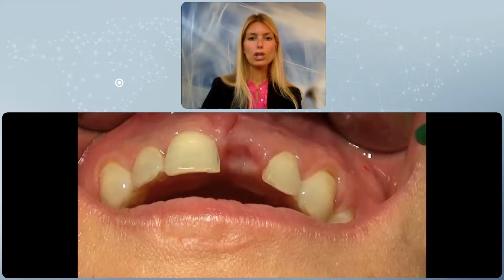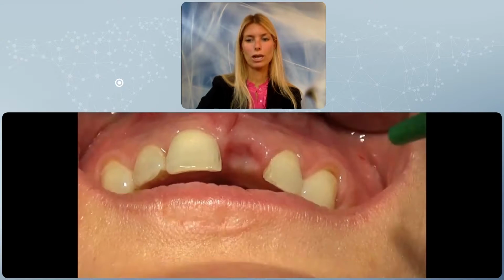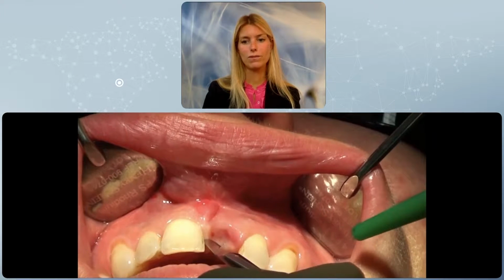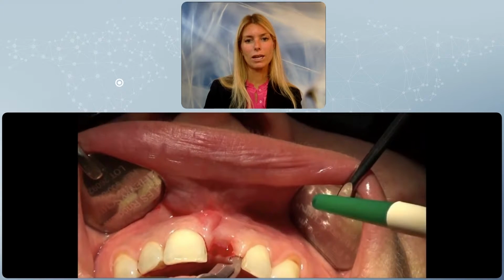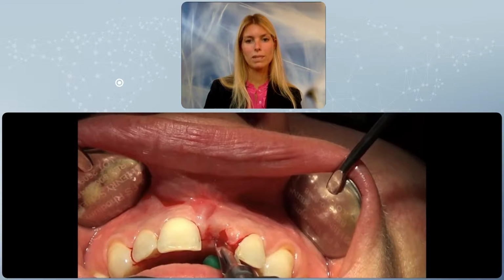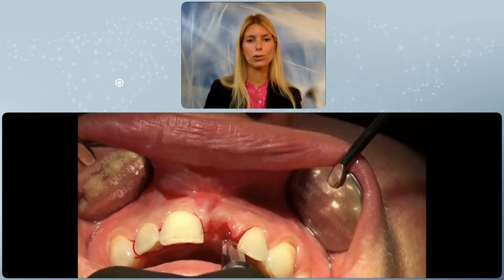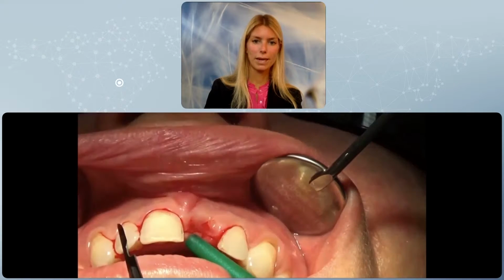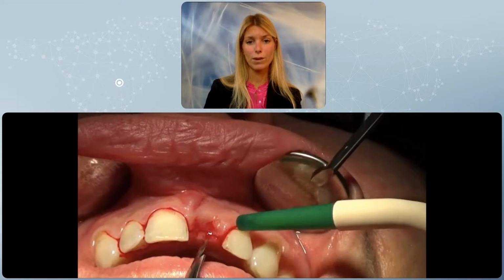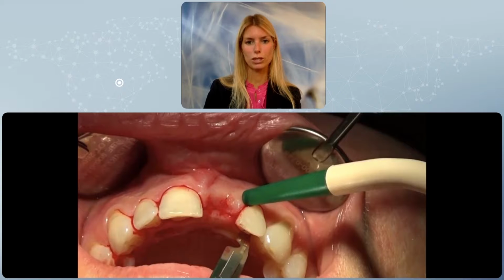So I will show you now a video of another patient with a very similar situation, and I would like to talk you through this video so that it will give you exactly the tips and tricks about it. So a mid-crest or full thickness incision is performed in a very slow, very controlled way, to allow a 90-degree incision between the papilla and the intrasulcular incision. This is very important to have a complete closure when we have finished our augmentation procedure.